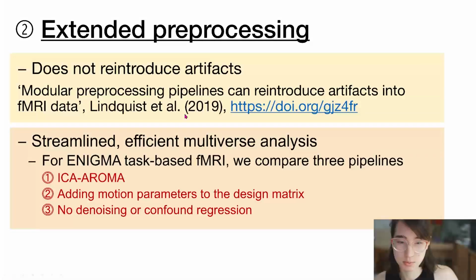So HALFpipe has been written with a lot of care to make sure that our denoising works as it should. But it's a really interesting paper. I can really recommend to check it out. It's also super interesting about the secret life of the data underneath what you see, the commands that you run.